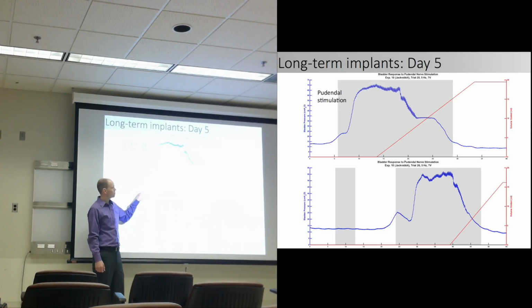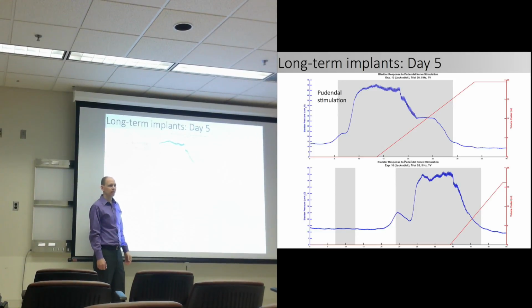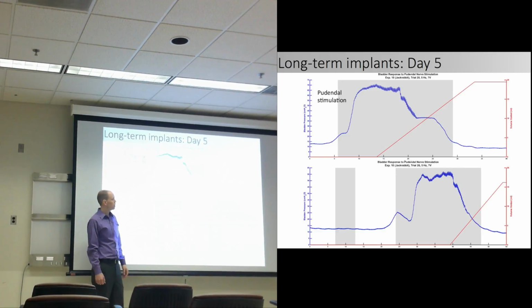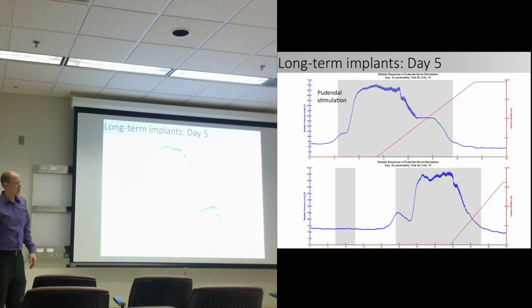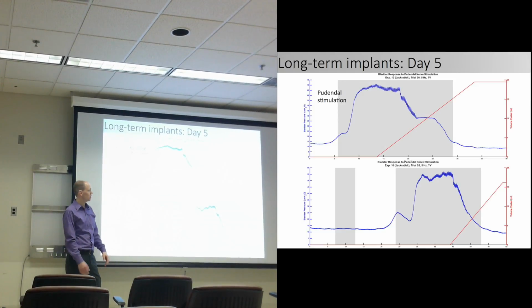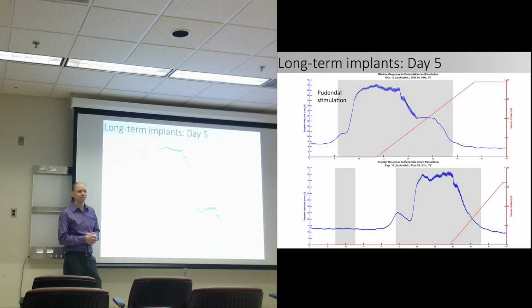So this is not necessarily novel, it's something we've shown before. But I was excited to see that in a survival animal, I could get nerve-driven bladder contractions. I don't know if it's completely empty, because it didn't empty out the bladder, but the amount of volume that came out is correct. Ultimately, what I'm working towards as well is, a lot of my colleagues have great videos of non-human primates moving their arms or animals walking on treadmills. I love it. We've got some video recordings of this and basically edit to show voiding along with our bladder pressure and with our neural recordings as well.